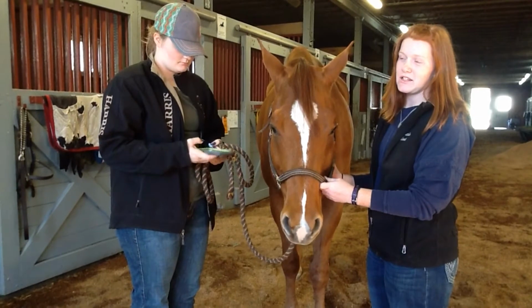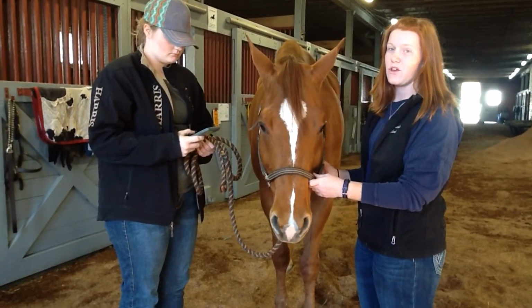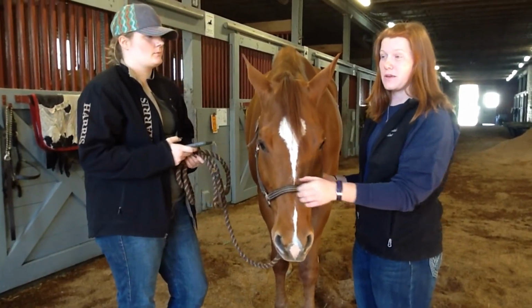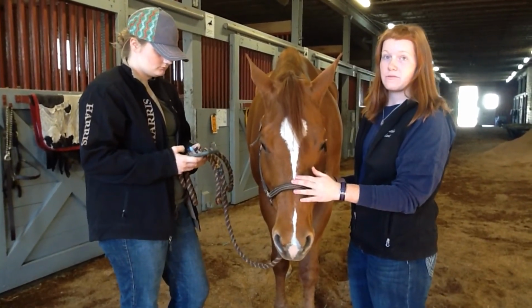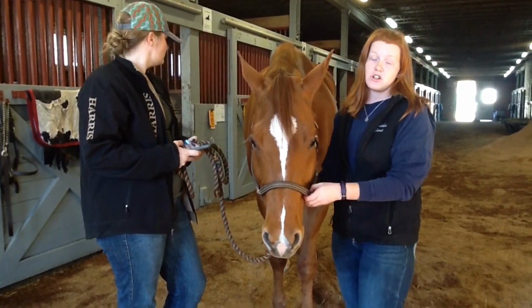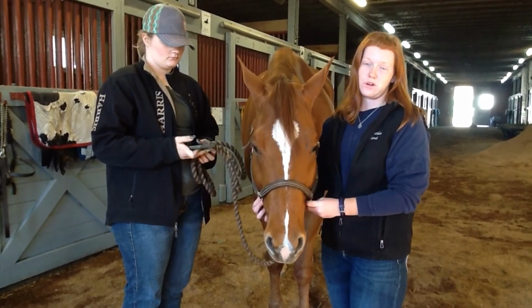Oftentimes whenever you're timing, it is a good thing between you and your timer to have keywords. So like I said start and she said stop, so those are our keywords. Other people might say go, and other people have other ways of doing it. But 8 by 4 is 32, and 32 does lie in our normal range, and our normal range for a maxillary heart rate is 32 to 44 beats per minute.